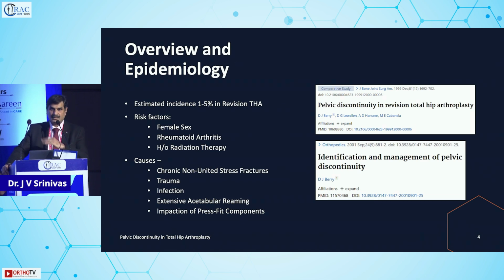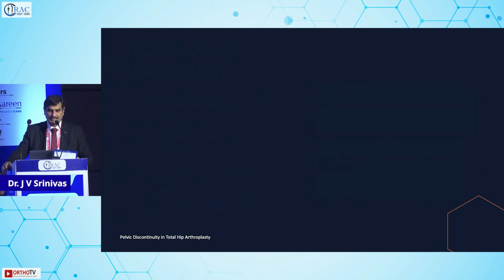One of the few cases Dr. Ramnik showed and many other speakers showed. Excessive reaming causes pelvic discontinuity, and impacting a cementless shell in a very hard way breaks up the anterior posterior column and the medial quadrilateral plate. That is iatrogenic pelvic discontinuity.